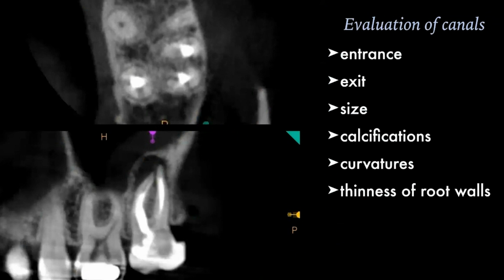One of the things about seeing the canals on a CBCT is that sometimes when you are reading CBCTs, especially in the beginning, where you're seeing how much information is there, it's almost daunting, because canals that looked almost easy, quote unquote, you will actually be able to see all aspects of the curvatures. Keep in mind, canals are in 3 dimensions, so not only is it curving in one plane, it's often curving in multiple. And so knowing a lot more information also means that you can see a lot more about how difficult things can be.